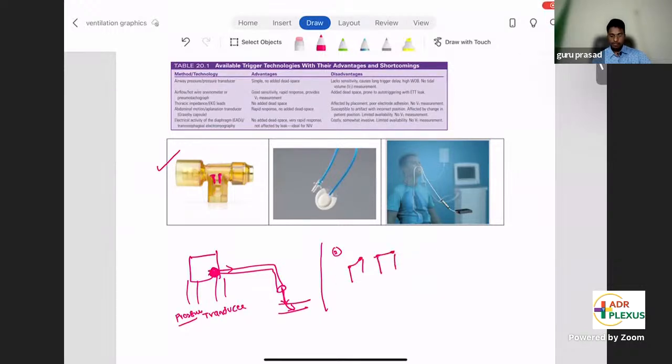So whenever the patient breathes, whenever air passes, because of some current generated continuously, these hot-wire anemometers are relatively hot, and whenever air passes through them because of the flow by the patient, when he's inspiring or exhaling, they become cold. And to make them hot, some amount of electricity is required.